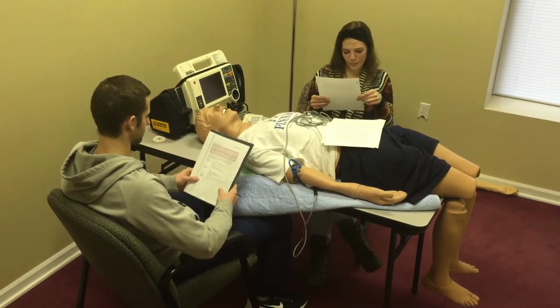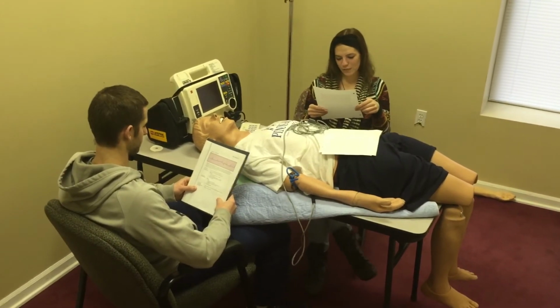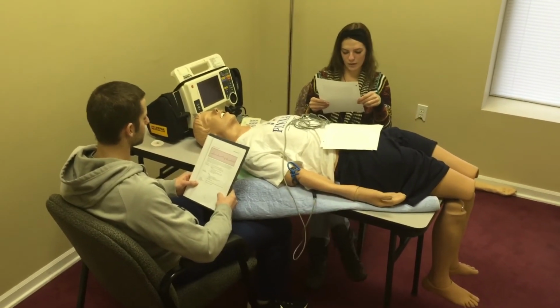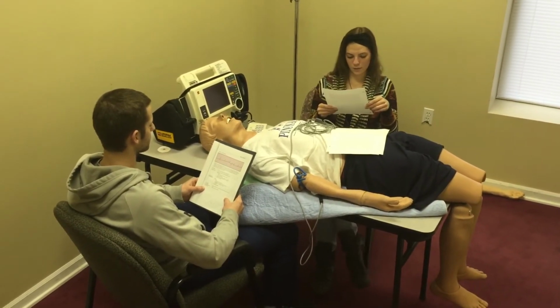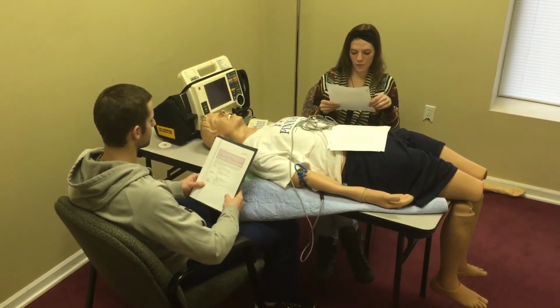The patient with the above rhythm is a 45-year-old man who has chest pain that is described as a pressure, a 9 on a scale of 1 to 10, radiating to the left shoulder. It has been constant for the last 20 minutes. He also complains of shortness of breath and nausea.